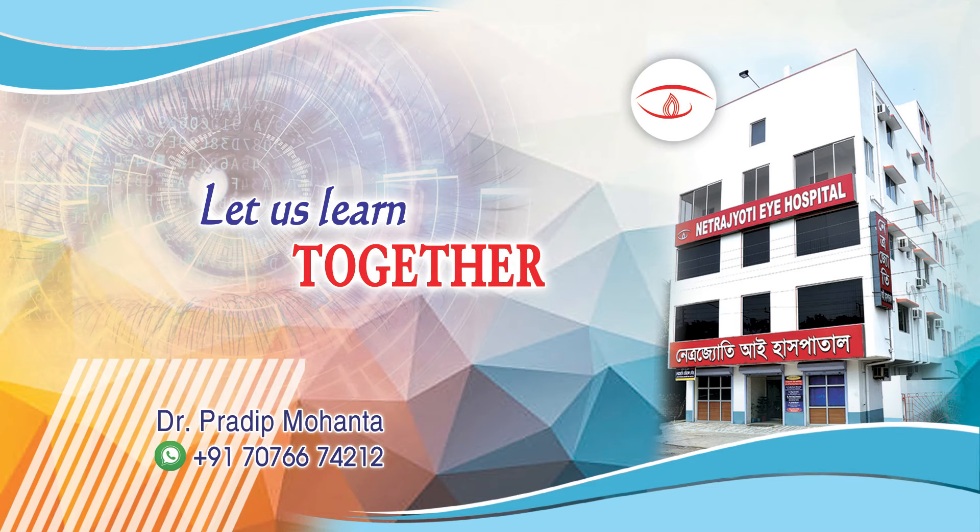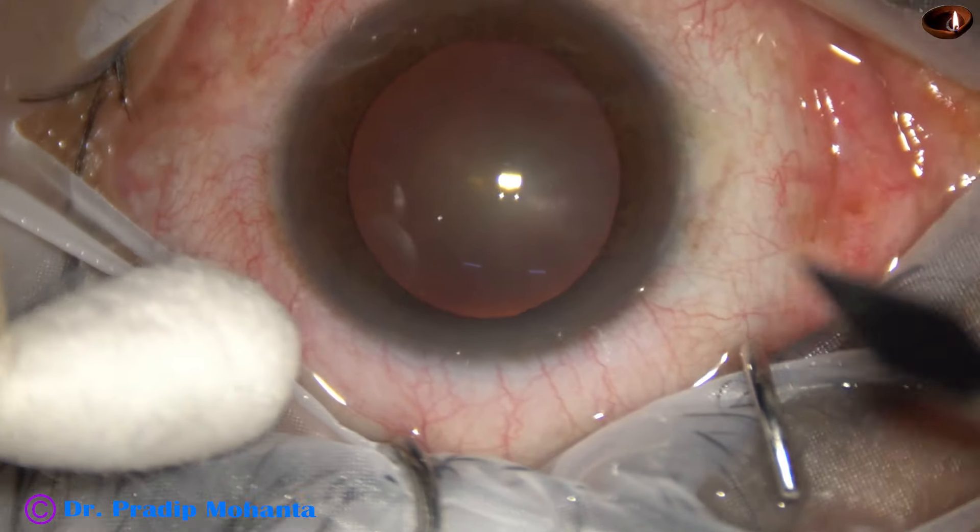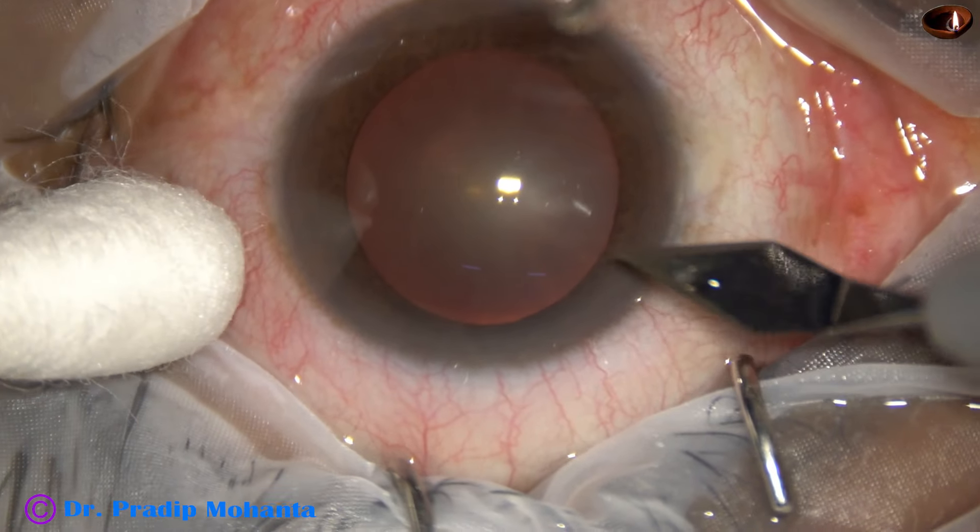Friends, welcome to my workplace at Ranaq Heart, West Bengal, India. Let us observe this totally unedited phacosurgery.